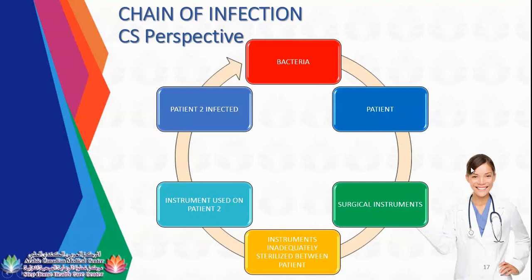So in order to break this chain of infection from the CSSD perspective, you need to address the instruments. You need to adequately sterilize the instruments, so you need to follow the protocols. You need to do the manual brushing, put the instruments in the ultrasonic machine, inspect the instruments, and sterilize the instruments with the usual standard protocols, especially in the autoclave.